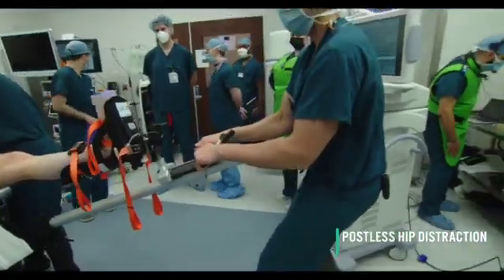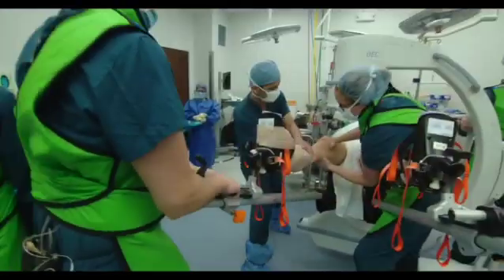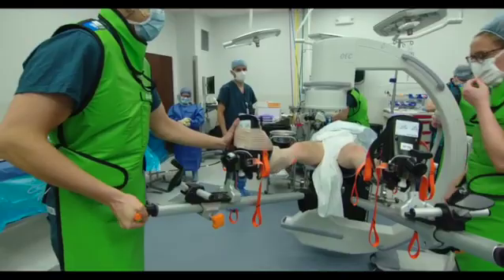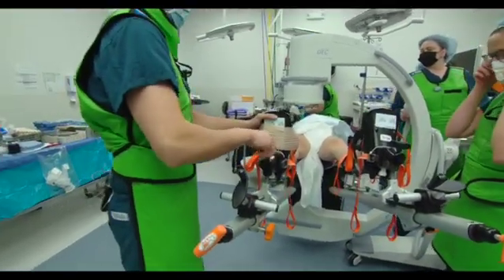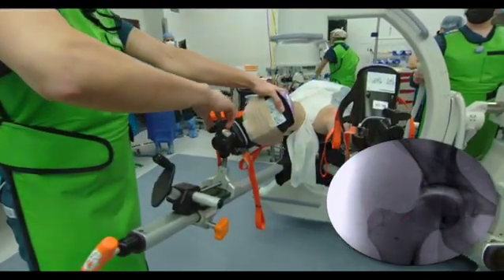Once the surgical limb is secured in place, distraction is sought by pulling the surgical limb caudally with the goal of achieving 8-10 mm of joint distraction. Upon assumption of adequate hip distraction, the leg must be positioned in 10-15 degrees of hip adduction and 20-30 degrees of internal rotation prior to fluoroscopic verification of achievement of the desired distraction.